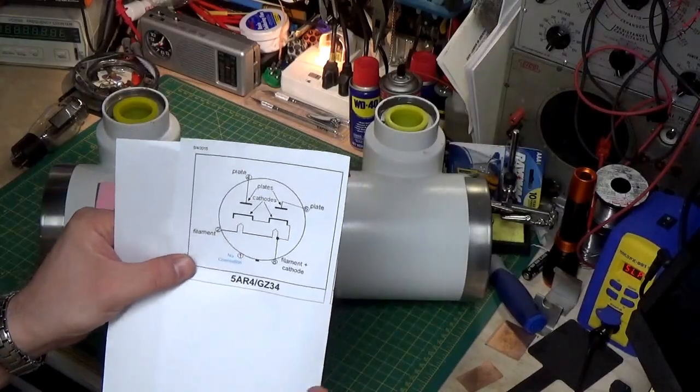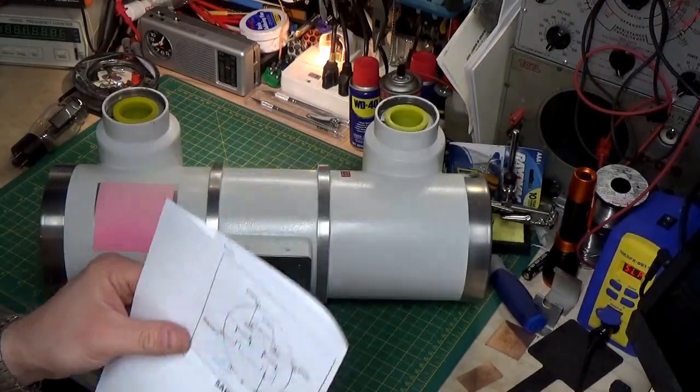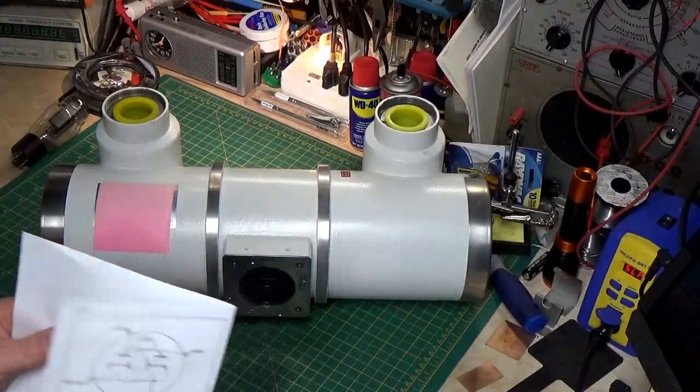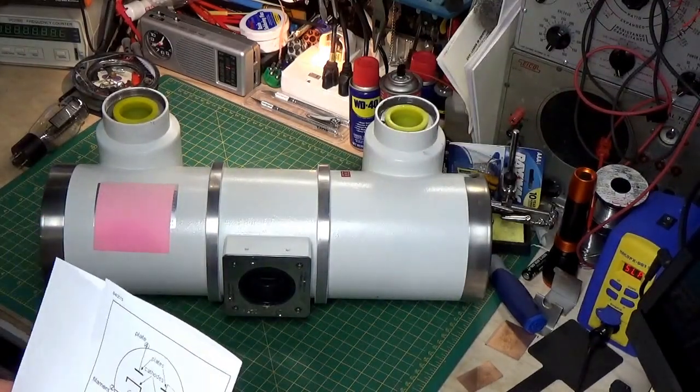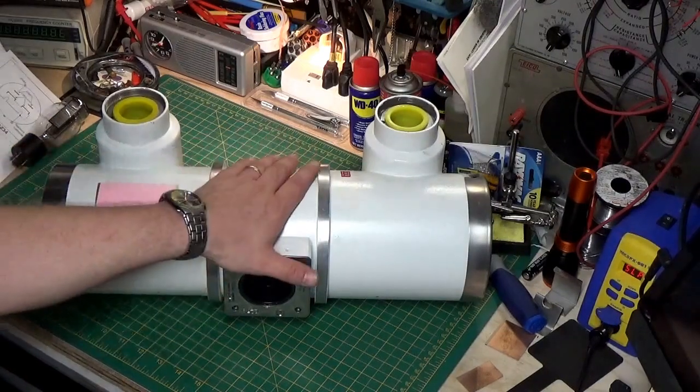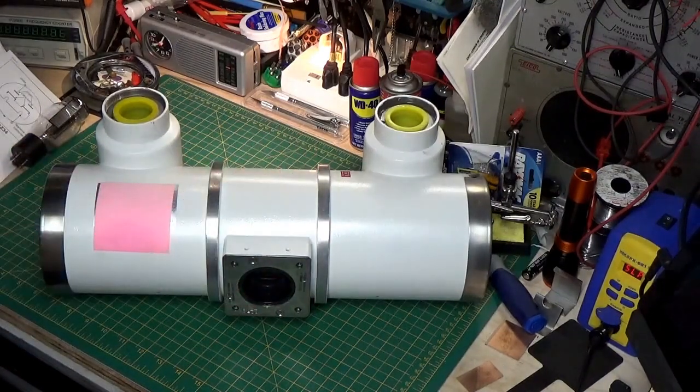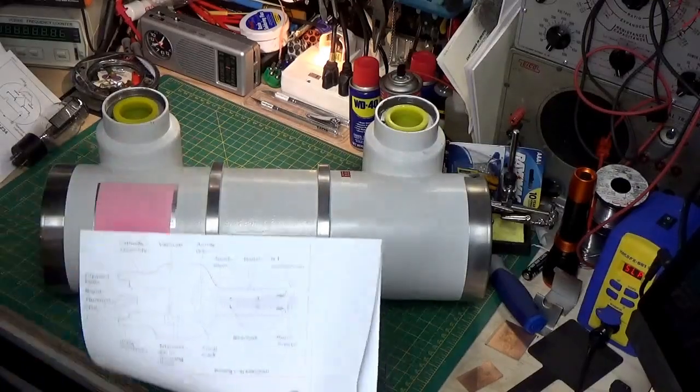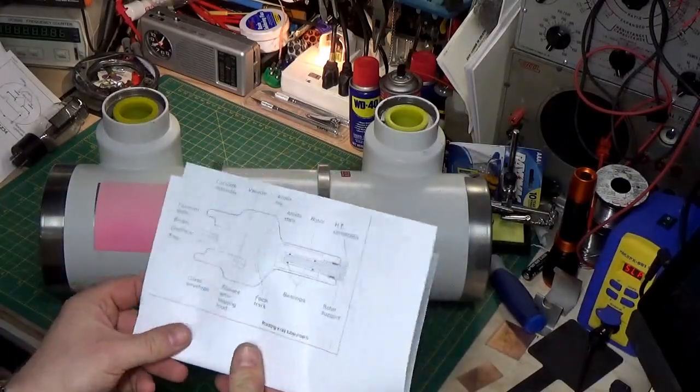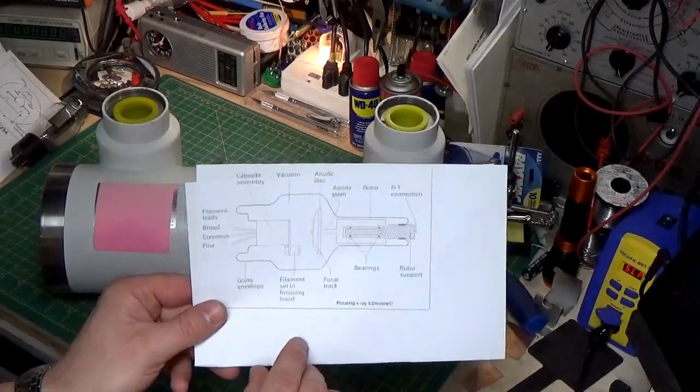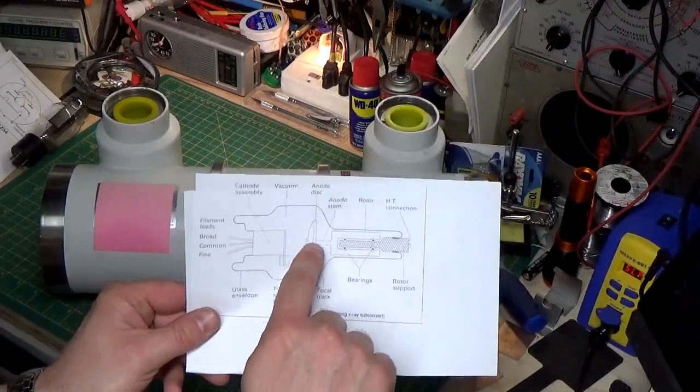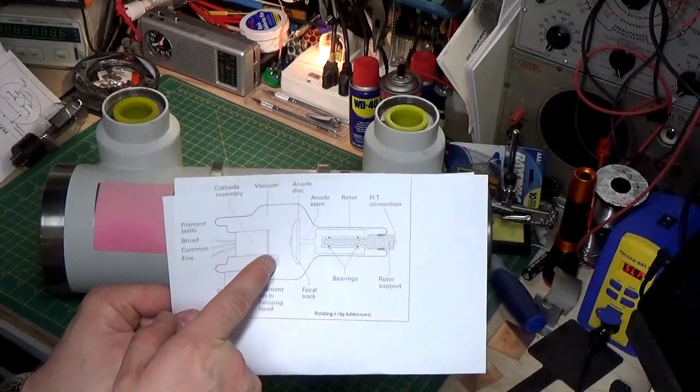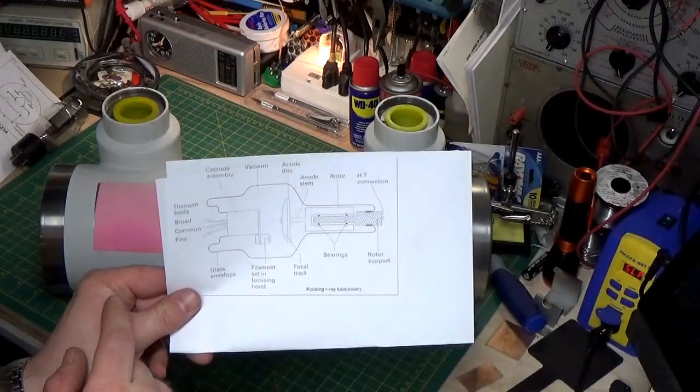Now we know that a diode will conduct in one direction, but not in the other. That's what normally what we use a diode for, is to convert AC to DC. Now, what's inside this housing is basically the same thing. You have an anode and you have a directly heated filament, or cathode.